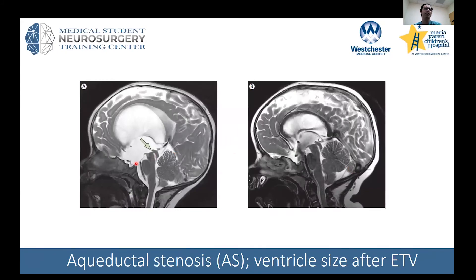Here is an example of a patient who had ETV for aqueductal stenosis and the ventricles came down afterward. However, that's not always the case. VP shunt is a much more effective way of decreasing ventricle size, whereas with ETV you don't always see such a dramatic decrease. Studies are still ongoing to determine if that difference has clinical significance.